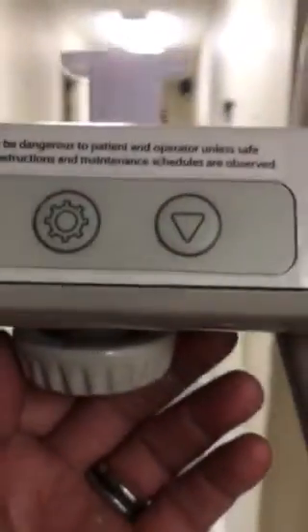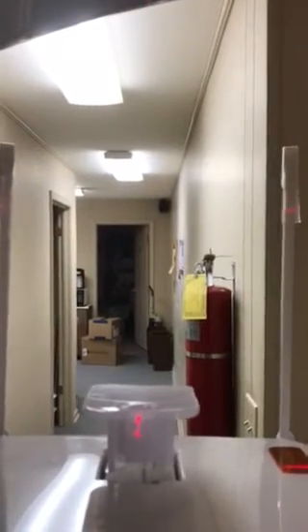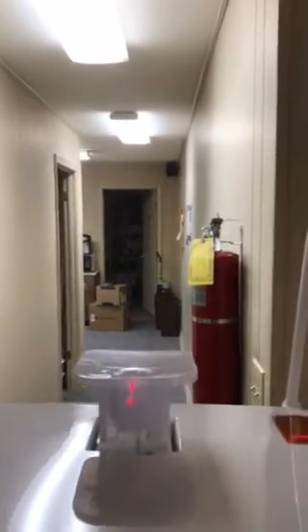Okay, once you got them where you want them, you've got a dial here. That's how you will close the earpieces onto the patient's head. They do not close automatically like on the other pan, but that's how you do that.